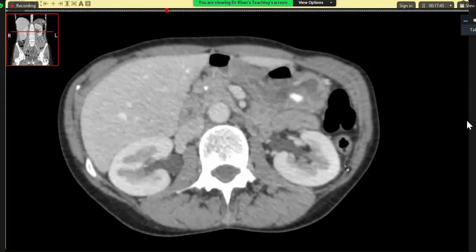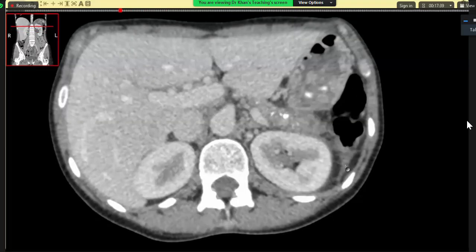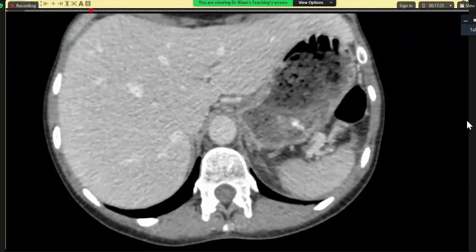Another feedback is that you said that there is no pneumoperitoneum, and then you asked for a lung window. So it should have been vice versa. You will say that I want to see a lung window to rule out pneumoperitoneum. So that's fine, but there was a bit of fine touch. Okay, thank you. Thank you, sir.